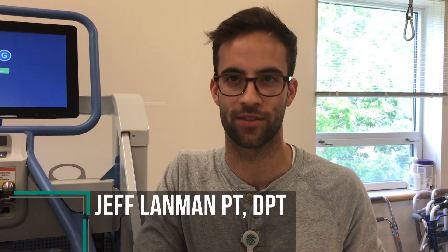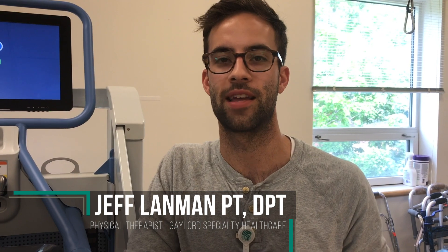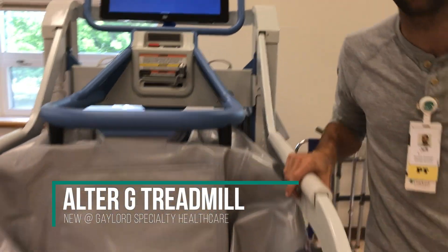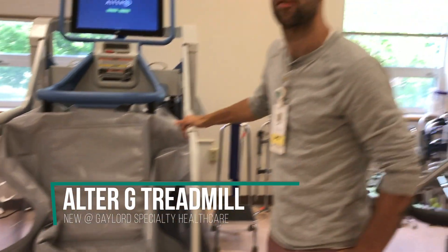My name is Jeff Landman. I'm a physical therapist at Gaylord Hospital in the outpatient department. Today I'm showing you our new Alter-G treadmill, which is a pneumatic air-powered treadmill. It can reduce the amount of body weight percentage that you are allowed to walk on or practice gait — that is, walking.